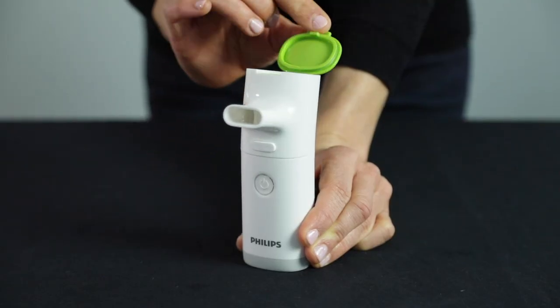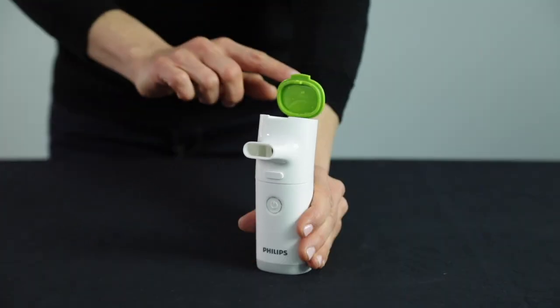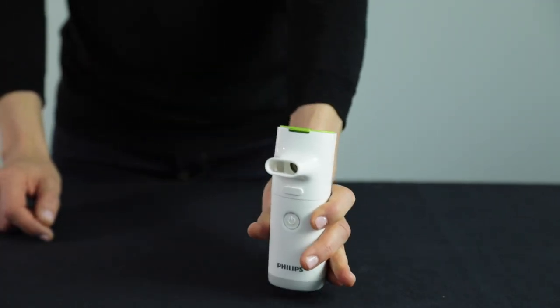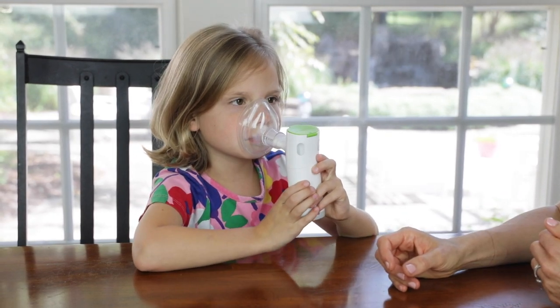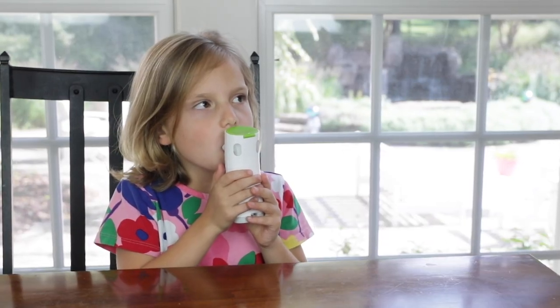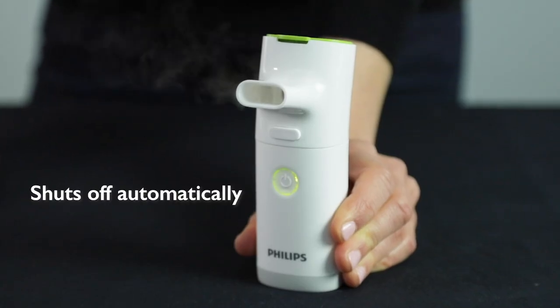To fill the medication chamber, you simply lift the lid and pour. It is important to note that you will not hear a click when you close the unit, but it should still be able to contain the medication securely in the mouthpiece. Start the nebulization and breathe in and out normally. You will notice that there will be vapor coming out the back of the unit — this is normal. Treatment time will be about four minutes for a standard medication dose, and once done the unit will shut itself off.